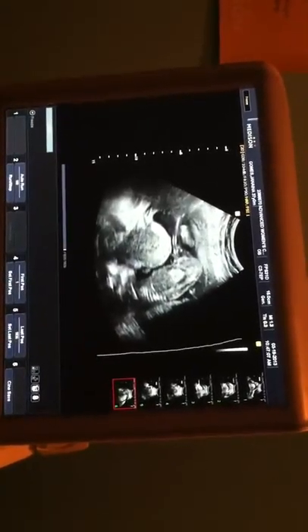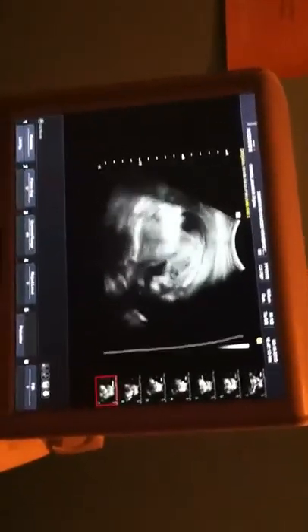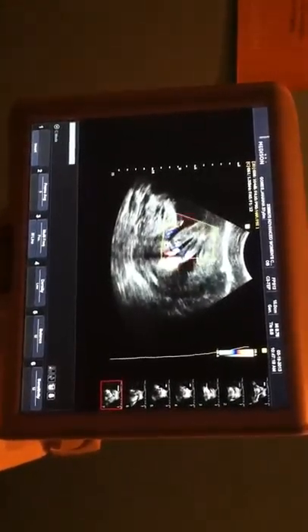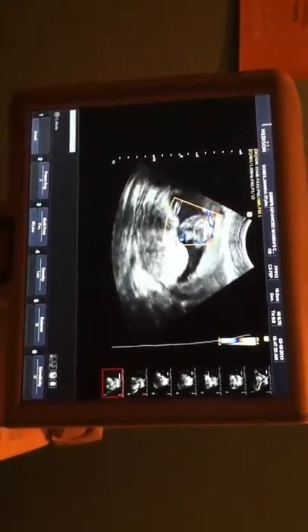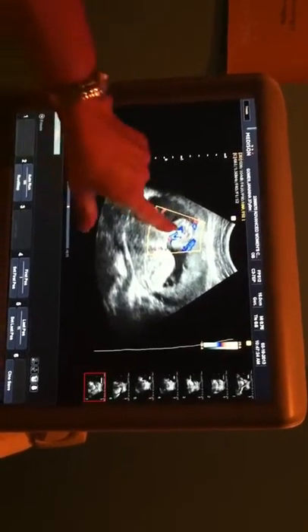There we go. The cord's hooking into the tummy there. This is picking up blood flow coming in through the umbilical cord right there and then branching off.